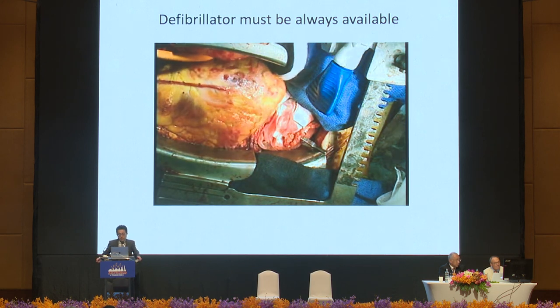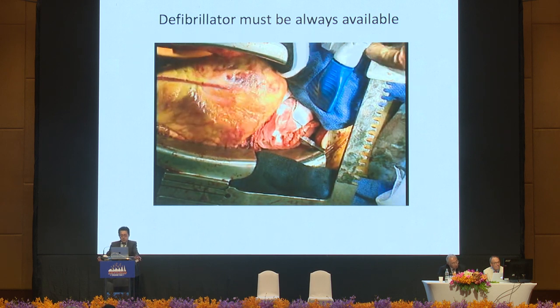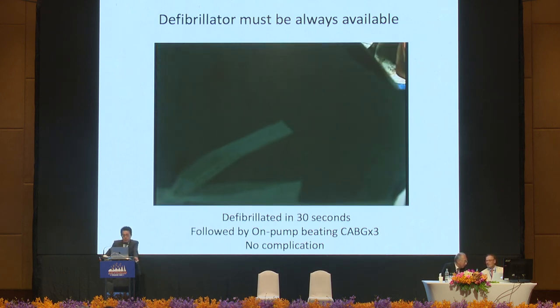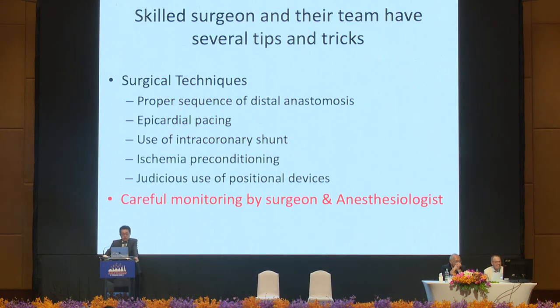Okay. It seems like a very long time, but it was just 30 seconds. So we followed with the on-pump beating CABG, with no complications. A good team should have several tips and tricks, such as surgical technique and careful monitoring. Today, I would like to add to my presentation some tips on the intracoronary shunt.